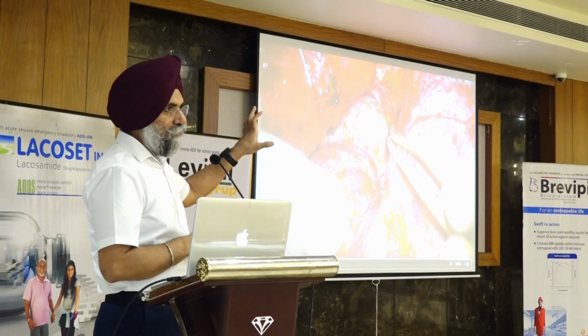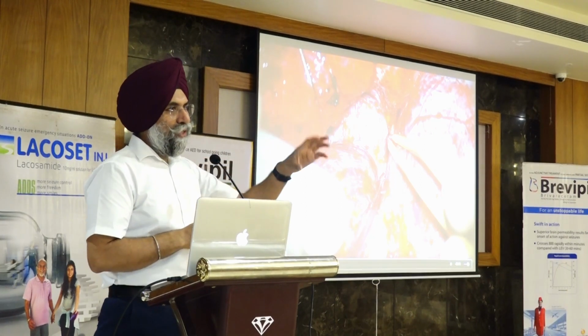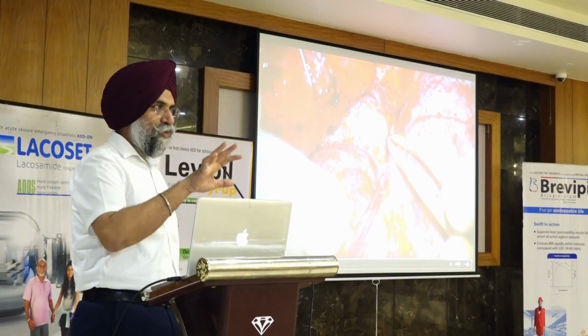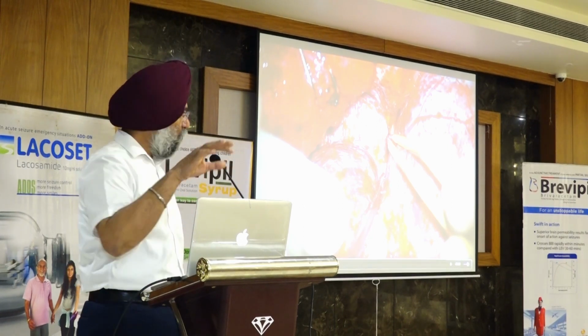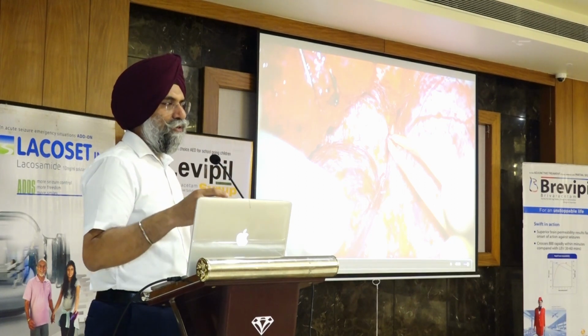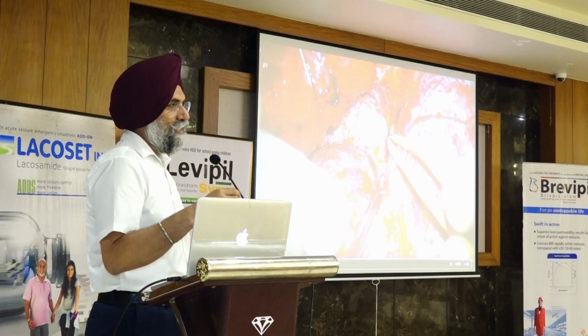So that way you have to correlate with your radiology where you are going to find it. So by and large, this is the picture in most of your cavernous sinus dissection. Once you have achieved this much of dissection, removing tumor or any pathology from the cavernous sinus is not difficult.